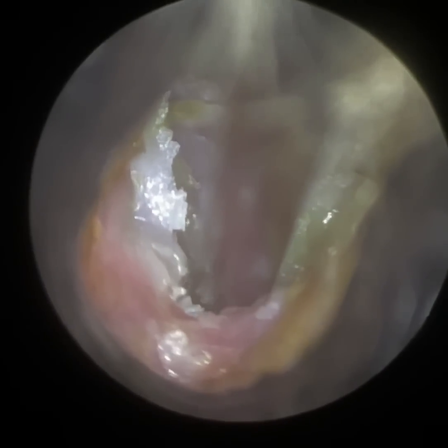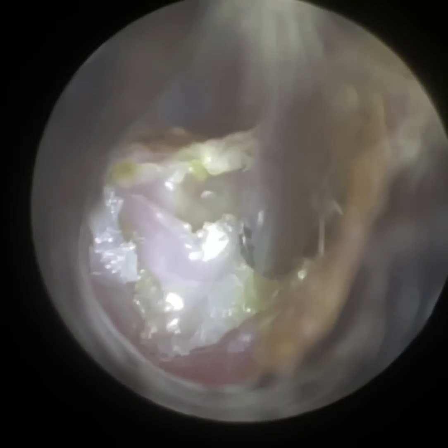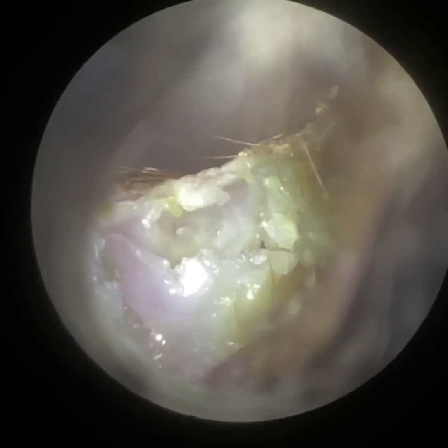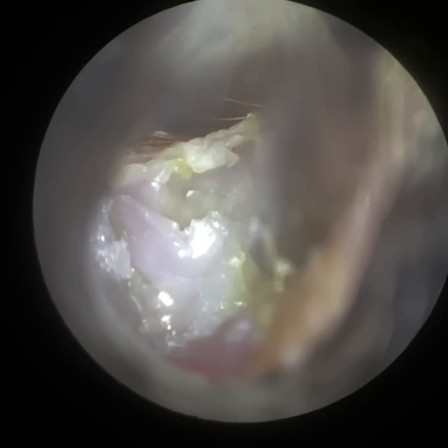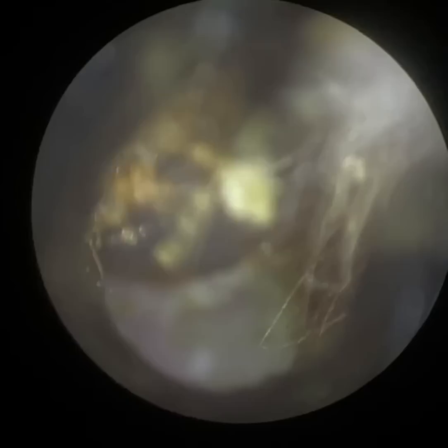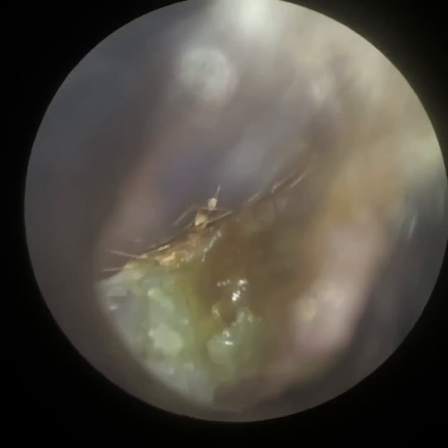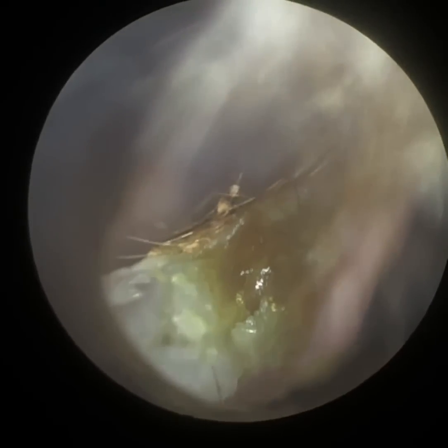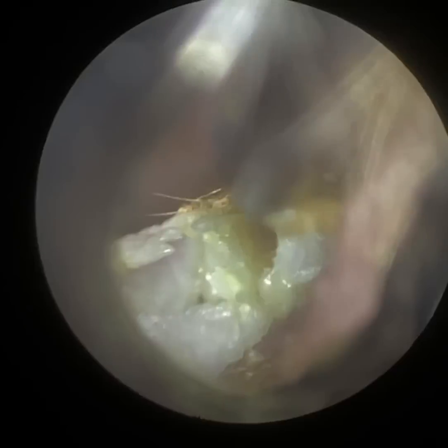Sometimes that just needs to be treated surgically, and they will need a CT scan no doubt. During the procedure, near the top part of that ridge, when I positioned the suction probe there, that bone was almost loose — I could compare it to a loose slab on your footpath or a loose roof tile. The bone was actually moving. Just that top bit — I'm not sure if you saw that with the tip of the suction probe when I just touched the top part of the ear canal.